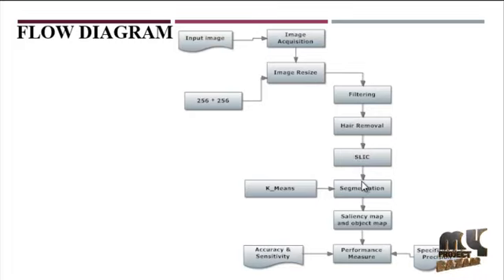Next is segmentation. The segmentation contains the k-means algorithm. Here we are segmenting the affected region in the skin images. The affected portion then goes to the saliency map object. A Canny edge detector is used here. Canny edge detection is a technique for extracting useful structural information from different vision objects and dramatically reducing the amount of data to be processed. It has been widely applied in various computer vision systems. Canny found that the requirements for applying edge detection on diverse vision systems are relatively similar. Thus, an edge detection solution addressing these requirements can be implemented in a wide range of situations.